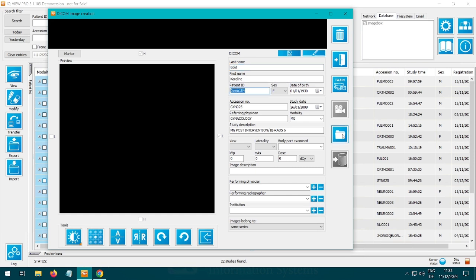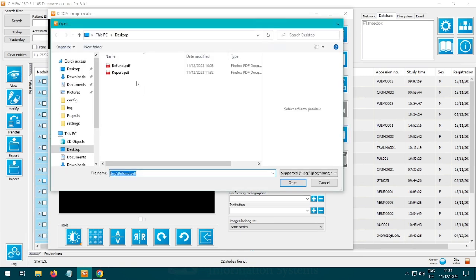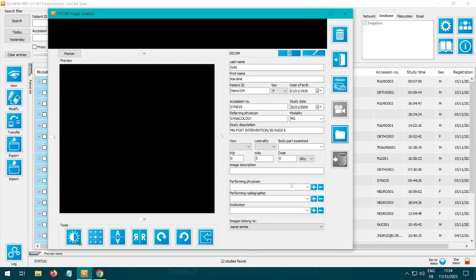The patient data is automatically entered here so that a direct assignment is possible. Click now on the button with the folder.